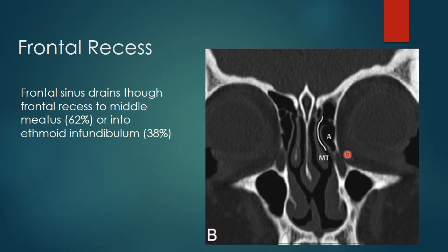An important structure to note is an anterior ethmoid cell in close relationship with the frontal recess, called the agger nasi cell. The importance of this cell lies in the fact that if it is very large or highly pneumatized, it can block the frontal recess, hence blocking the secretions of the frontal sinus, leading to stagnation and chronic sinusitis of the frontal sinus.